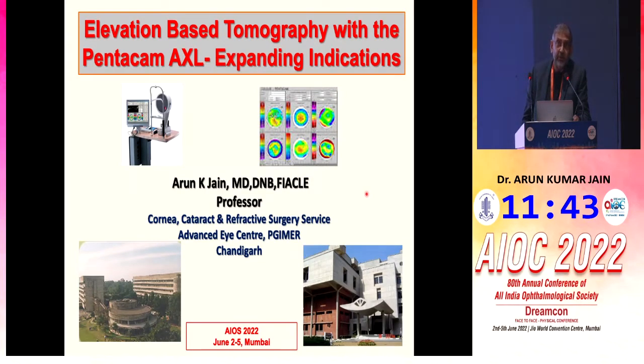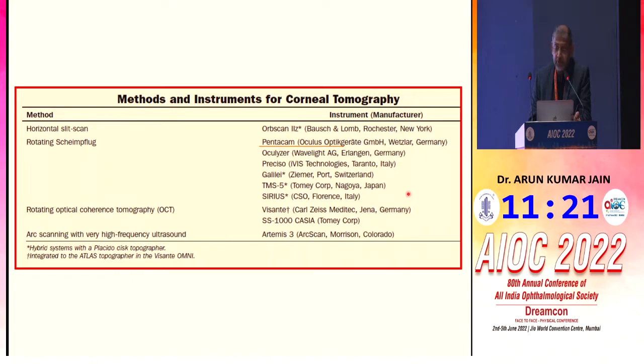There are a lot of indications, or a lot of problems where the Pentacam can be used, but I will be mainly restricting myself to the corneal problems and calculation of IOL power in post-refractive surgery. I have no financial interest in the subject matter of this talk.